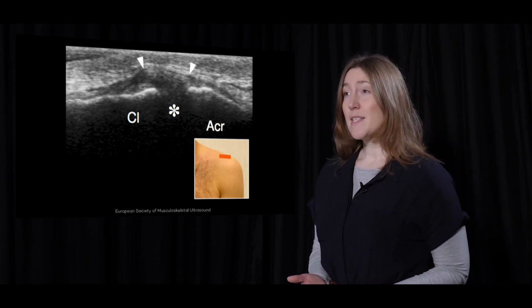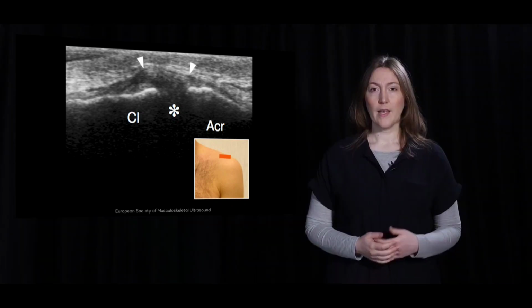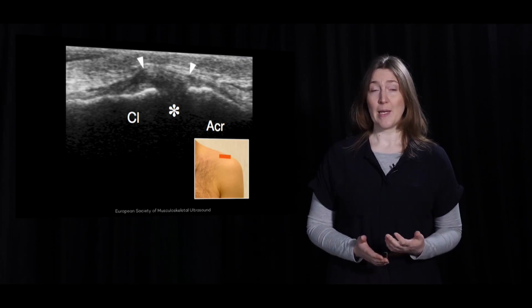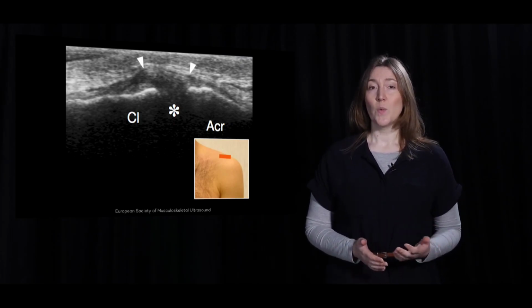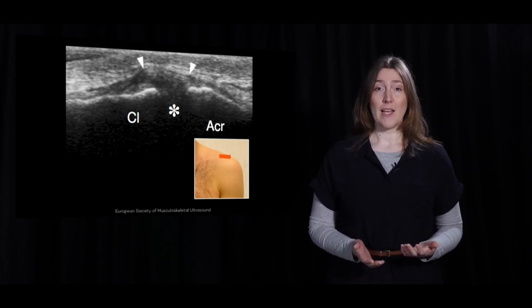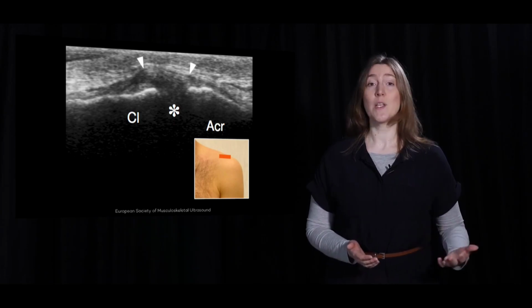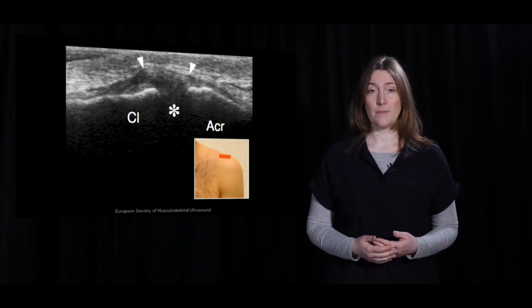The very positive side to this is that it allows us to make use of ultrasound. If bone would absorb the ultrasound beam like muscles and tendons do, we couldn't do ultrasound. There wouldn't be a reflection of the beam. There wouldn't be a returning signal, and thus there wouldn't be tissue visualization.